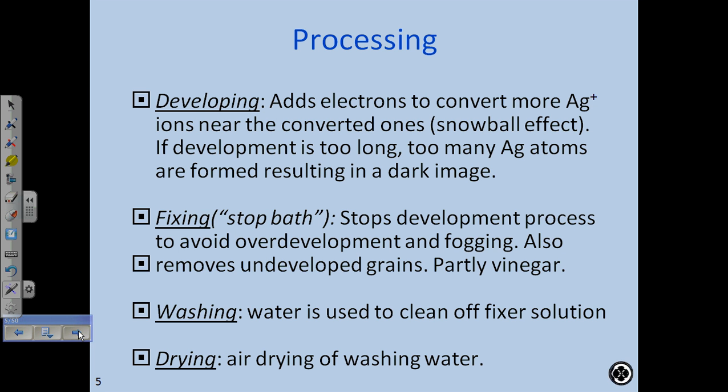Why do you think that, in those movies where somebody walks into a processing room, the light is always red? You notice that? The film is not sensitive to red. So film is made so that it's not sensitive to red light, and they're usually sensitive to green. Okay? Although there's always a little bit of film fog. Film fog is due to some light that creeps in under the door or that kind of thing. But anyway, getting back to the processor.